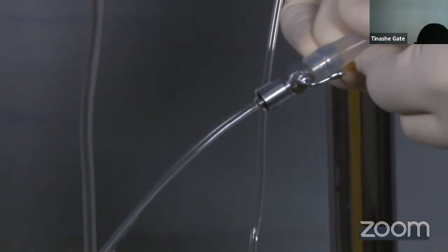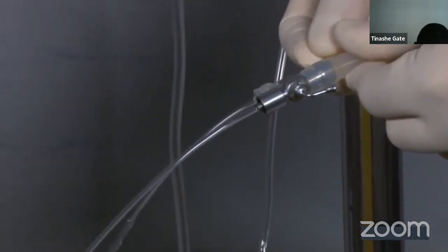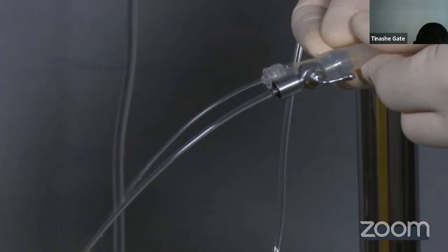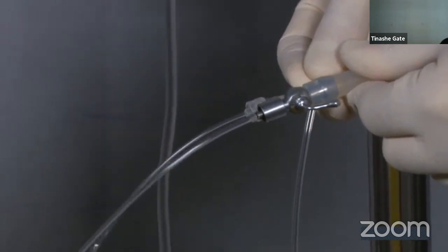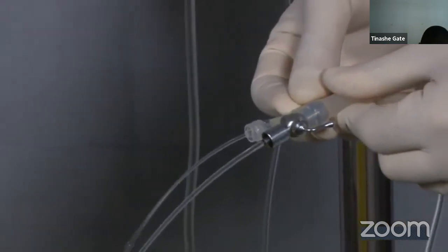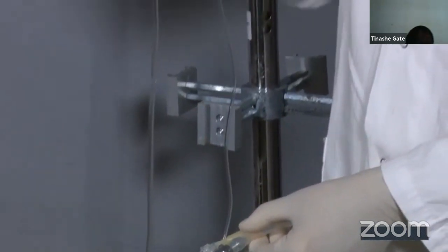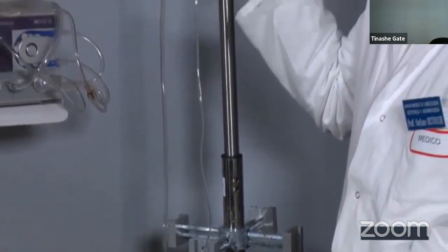You can see how much pressure is given on this tube only because there is much more flow. Here, the pressure is acting on a larger channel, so I have less resistance for the fluid to go out, while in the endovenous system, the fluid goes much slower because the channel is much smaller in diameter. You can see the difference, but the sacs are positioned at the same level. If I stay in this position, the second variable acts. The first variable is the diameter of the output silicone tubes. The second variable is the amount of liquid inside the sac.